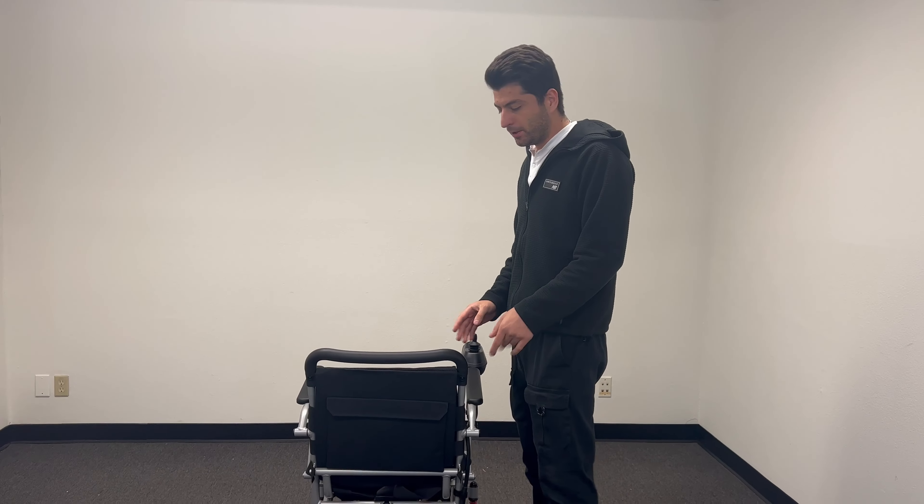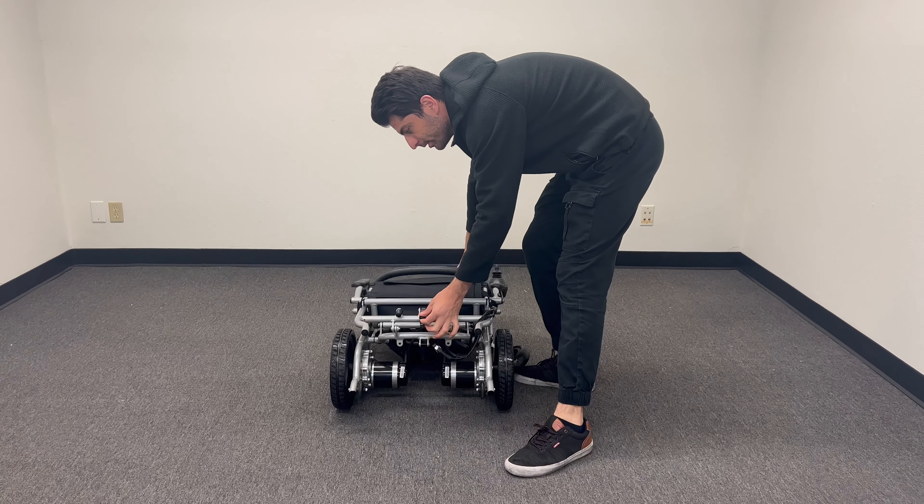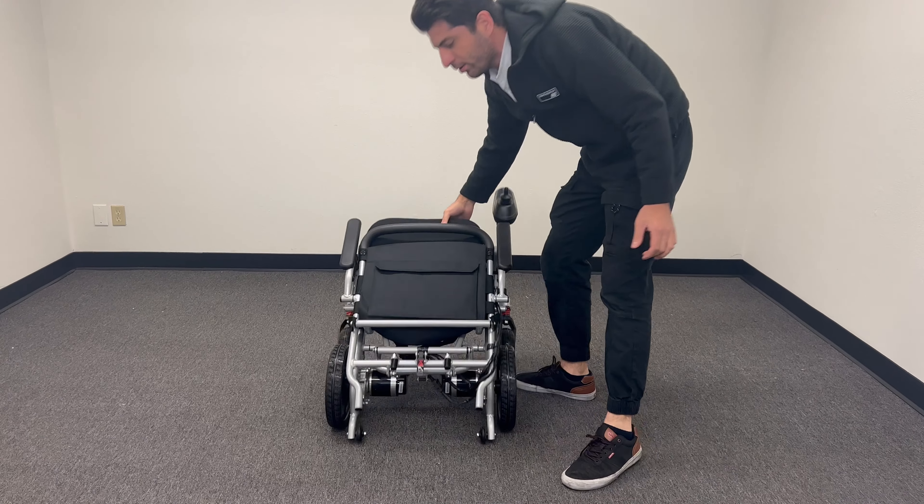Last thing is how to fold it. Right here there's a clamp, and then you can just pull it up.